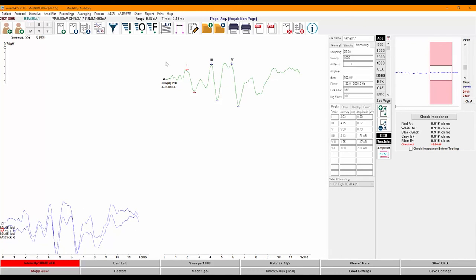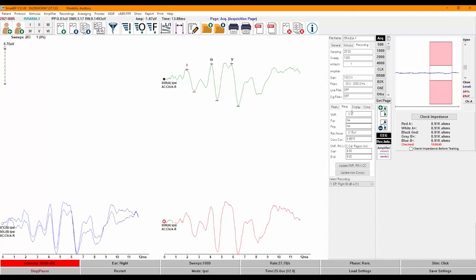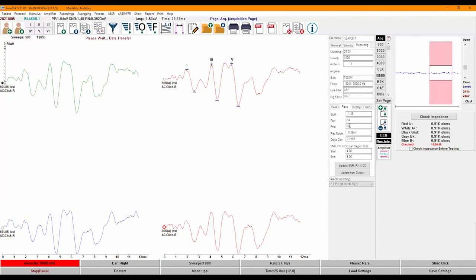You can select a recording either by clicking on it or by selecting it from the drop-down menu on the panel. When you have many recordings on the screen, you can also use the S key as a shortcut to cycle through recordings. Once a recording is selected and peaks are labeled, the peak information appears in the peak tab of the panel, showing the latency and amplitude of each labeled peak as well as the interpeak latencies. Switch to the response tab to find more information about the quality of the recording, including the signal-to-noise ratio (SNR) and residual noise.